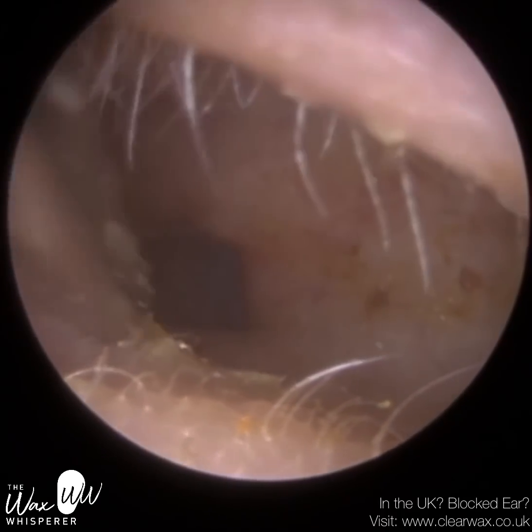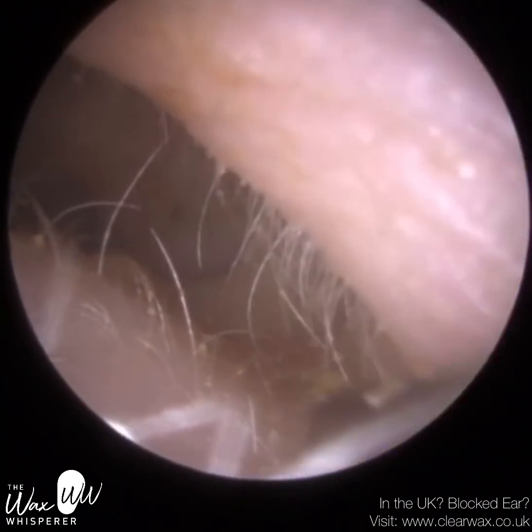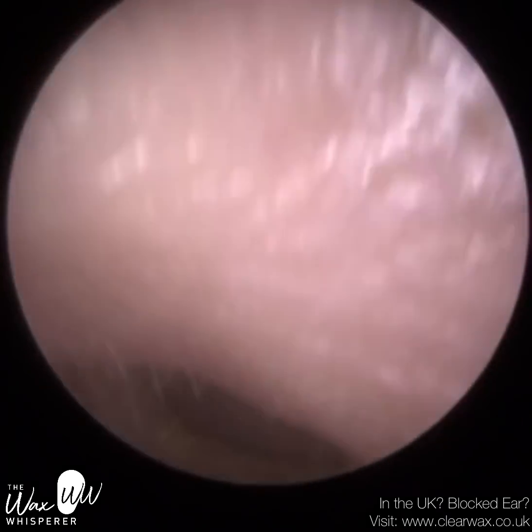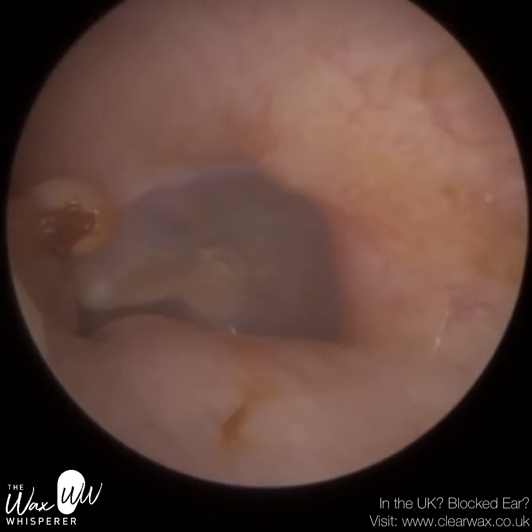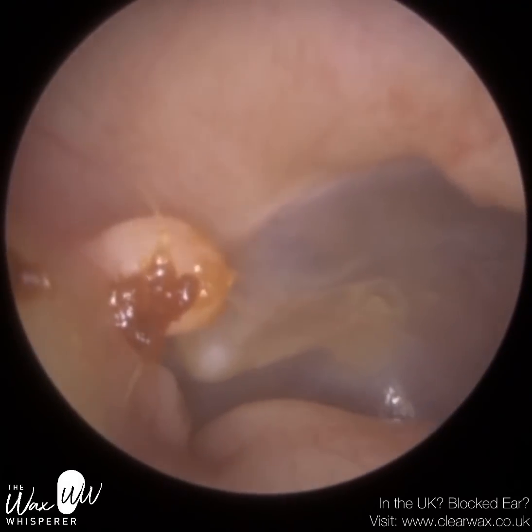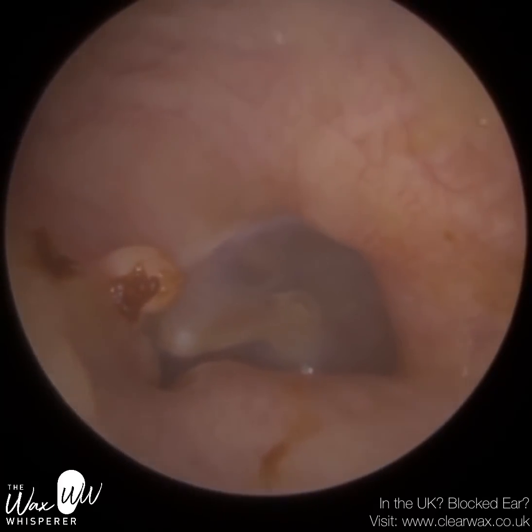Now, in the right ear, it's actually more pronounced. You can just about see the eardrum now. It hasn't affected the hearing because there is still a pathway for sound. You can see I'm going to remove that top one there, about 12 o'clock, 1 o'clock even.